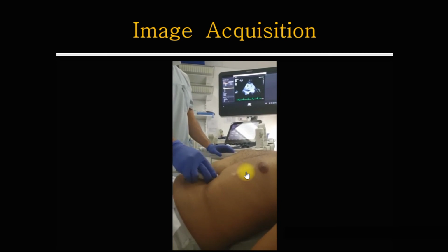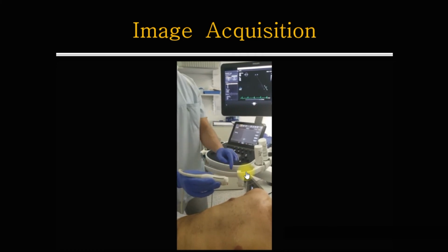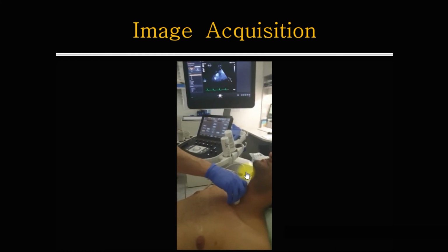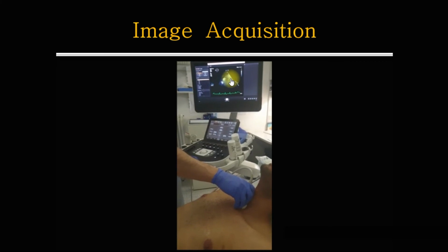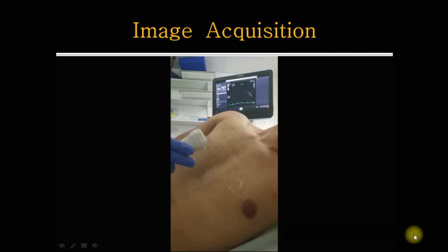Here, subcostal, here is inferior vena cava. Slight rotation from 4 o'clock toward 1 o'clock. Our last view that we will see is the suprasternal view. Suprasternal view, marker should be pointing toward 1 o'clock, and we will see the aortic arch, descending aorta, part of the descending thoracic aorta and part of the ascending aorta, and from the aortic arch, the great vessels are originating from the aortic arch.